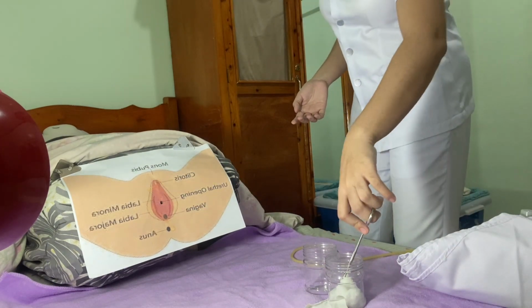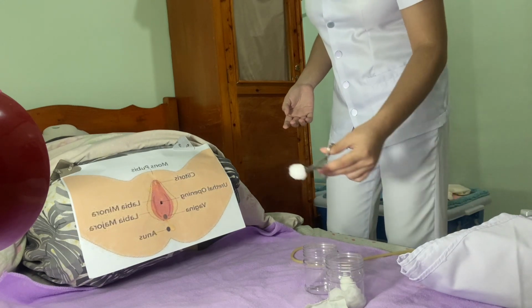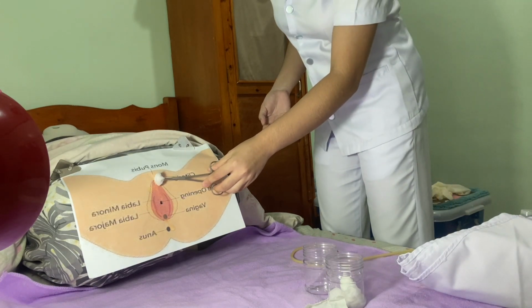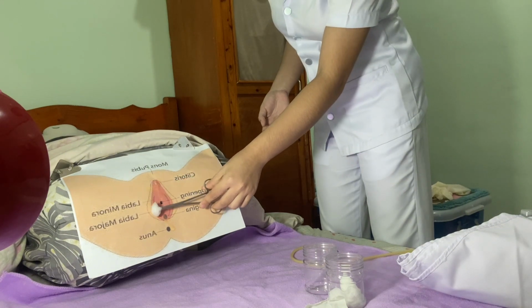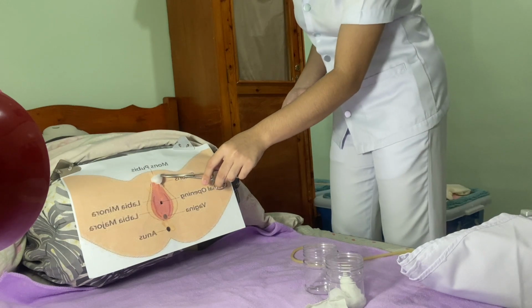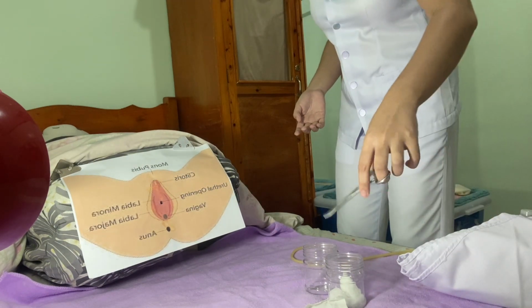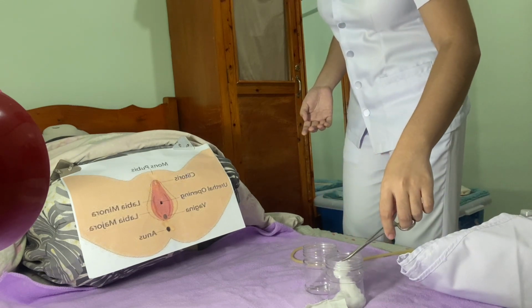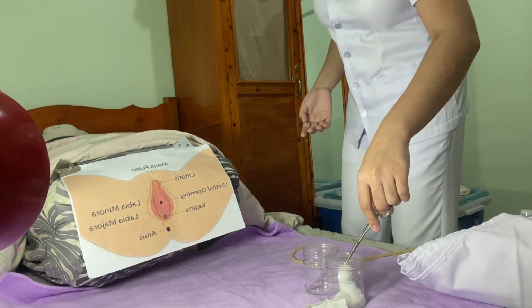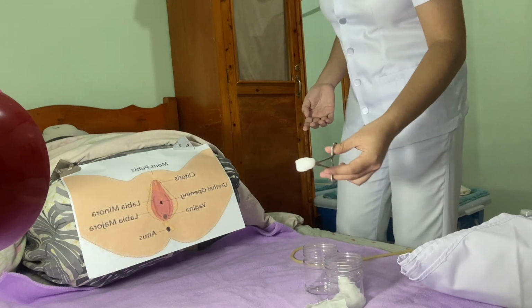So next, I am going to get another cotton ball for the labia majora, and discard, and for the other side, discard. So we have to remember that we should never retrace a stroke to ensure that we do not contaminate the cleansed area.